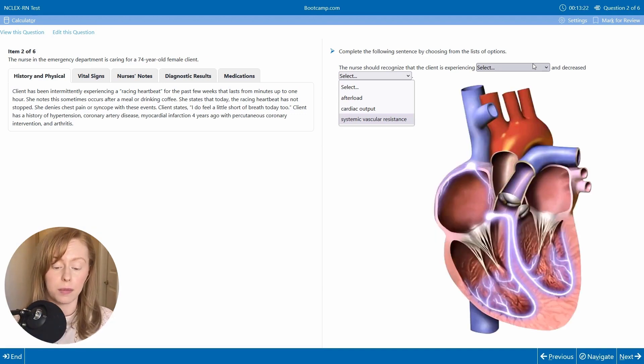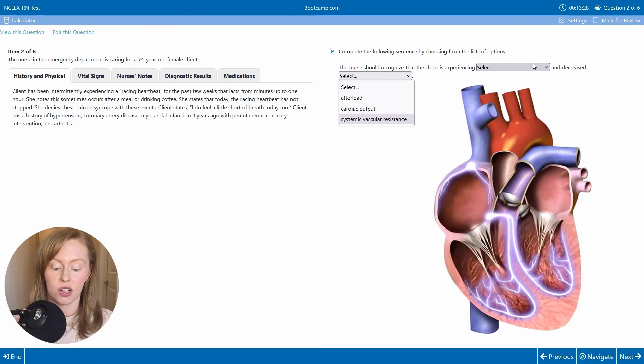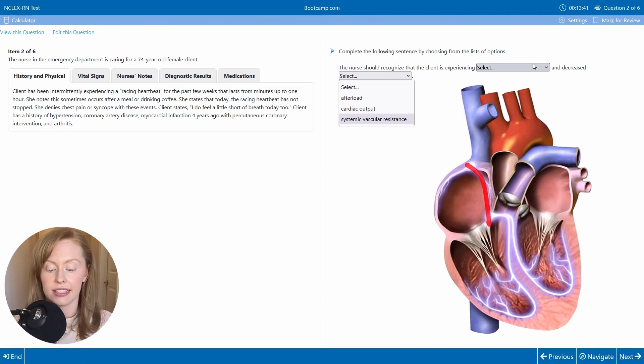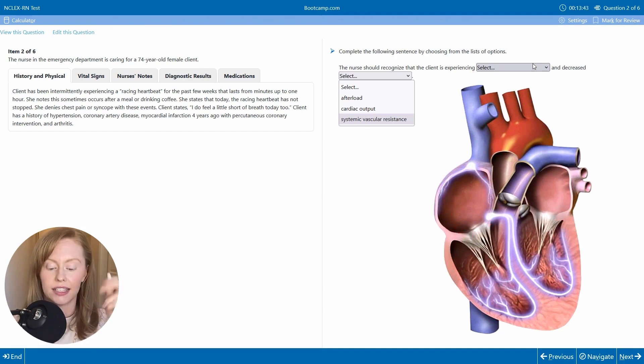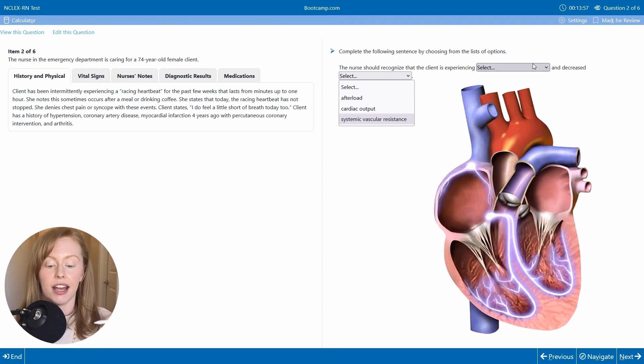And so your P wave, remember, indicates your atrial depolarization. What you're actually seeing is this electricity being conducted from the SA node in your right atrium.